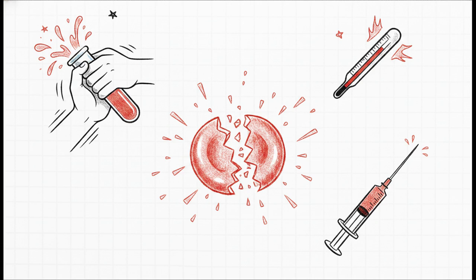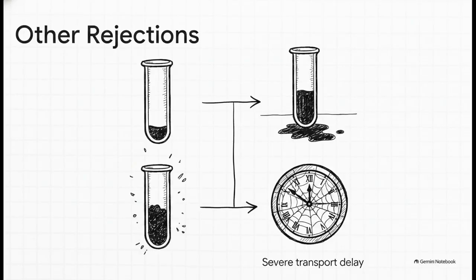Hemolysis is a huge culprit, for sure, but labs will also reject samples for other reasons. Maybe it was drawn into the wrong container, or there was an insufficient quantity, like we saw earlier with that strict 9:1 citrate ratio, or maybe a specimen that requires whole blood ends up clotted. Add to that leakages, unlabeled samples, or excessive delays in transport, and you really start to see the absolute minefield lab technicians navigate every day. And remember, these aren't just administrative inconveniences. They are major patient safety issues.